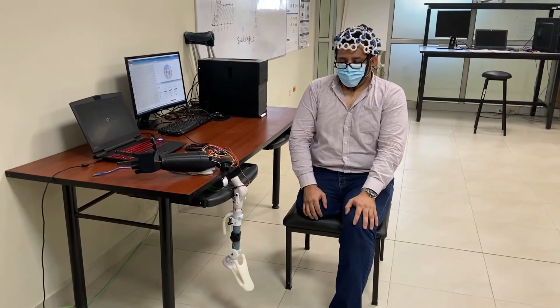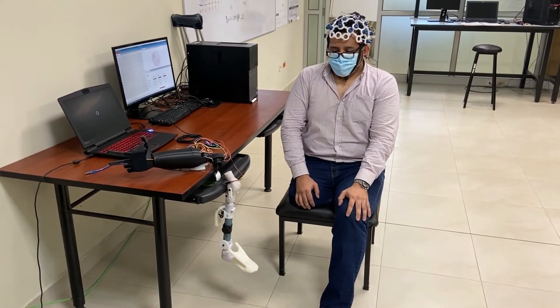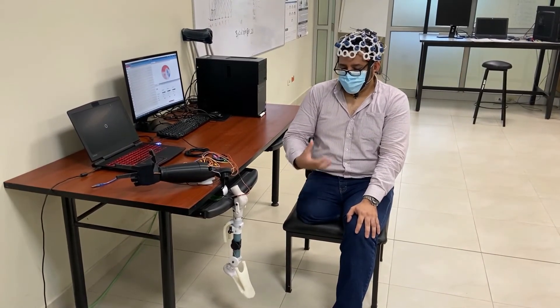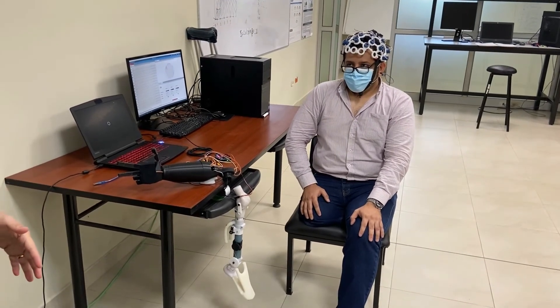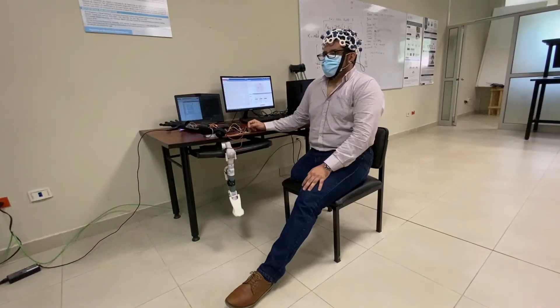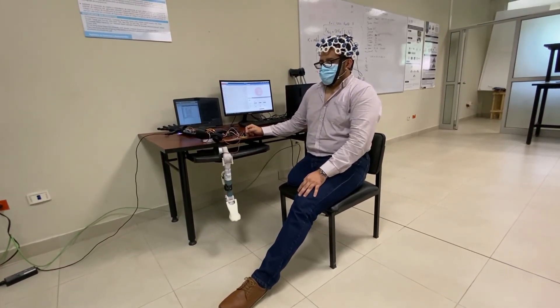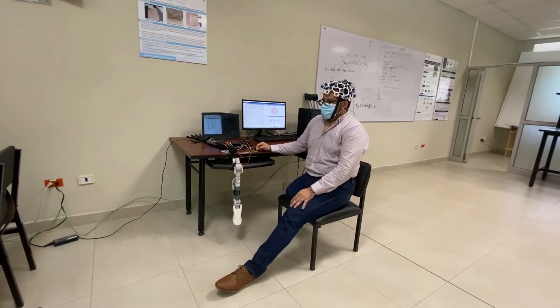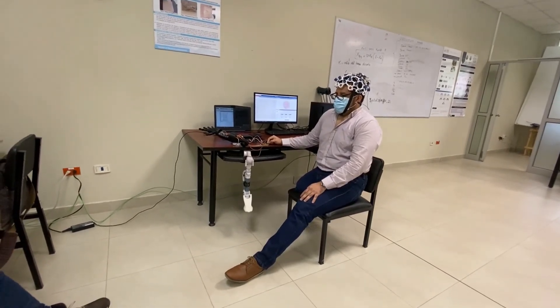Now we will do the test with a volunteer who did participate in the data recording. The test subject has a right lower limb amputation. First, the subject watches someone else raise the right foot, then sees the foot go down. This is due to mirror neurons — empathy allows control of the leg while watching someone else move the foot. Now we will do the prosthetic foot control, watching someone else moving the foot. The volunteer raises the foot and then lowers it.